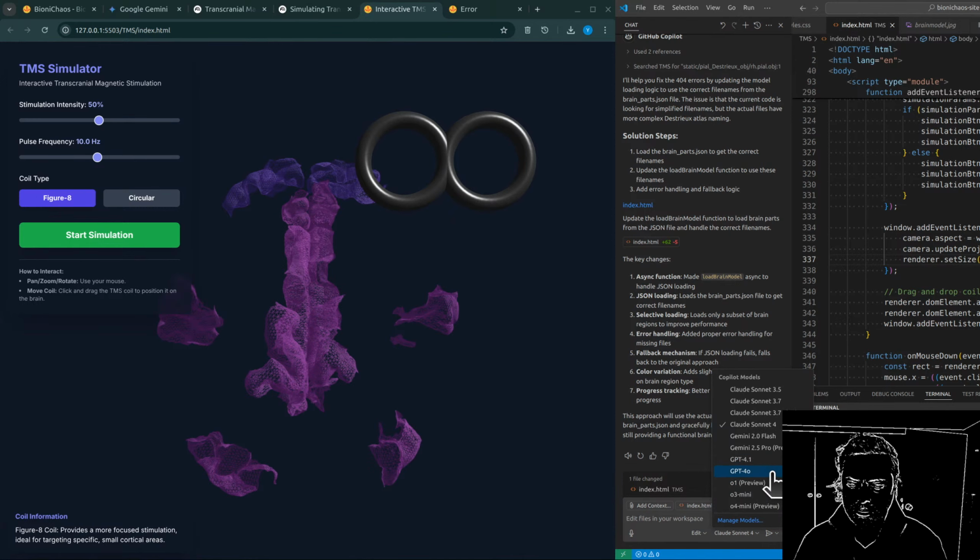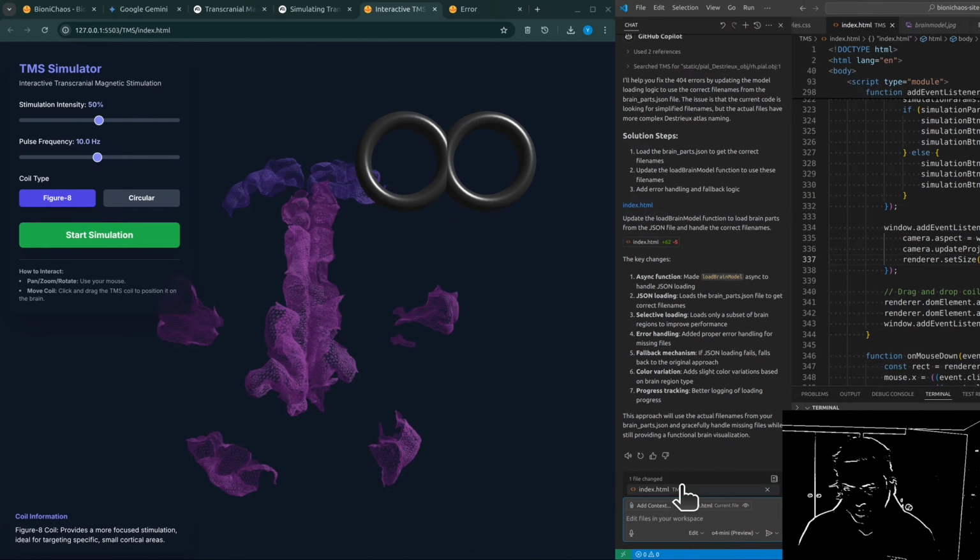Highlights the need for precision, doesn't it? Absolutely. Small errors in the head model or coil position can lead to significant differences in the calculated E-field. Makes sense. What software tools are typically used for this specific E-field modeling part? Well, SimNIBS comes up again as a primary tool here. It's known for calculating the E-field with high precision. And it has visualization tools too, you said. Yeah, powerful visualization tools. So you can actually see where the field is predicted to be strongest within the brain model, which is incredibly useful.